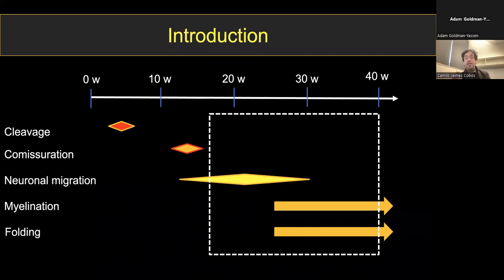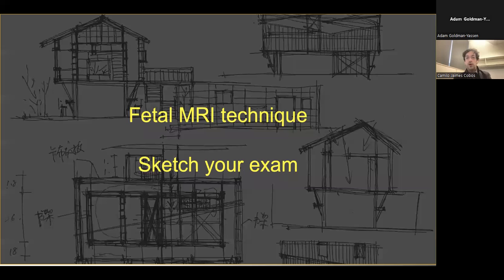I think it is a very interesting question whether the recent changes in access to healthcare and pregnancy and abortion services will shift our window and make us look earlier on to perform some counseling. But as things stand, this is really where the bulk of our fetal imaging occurs.